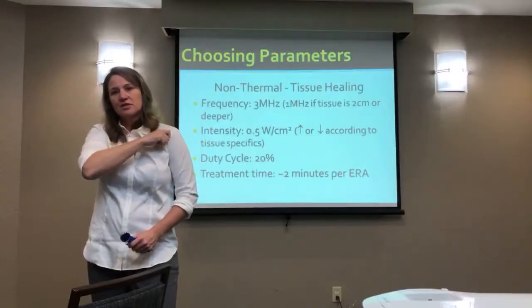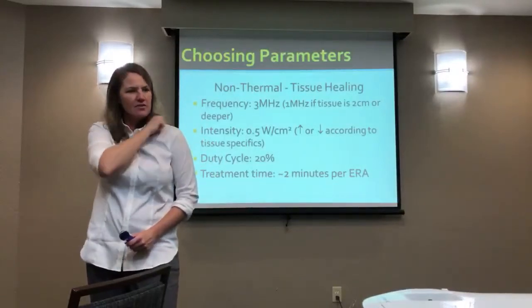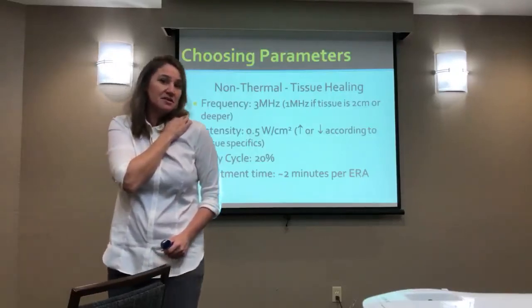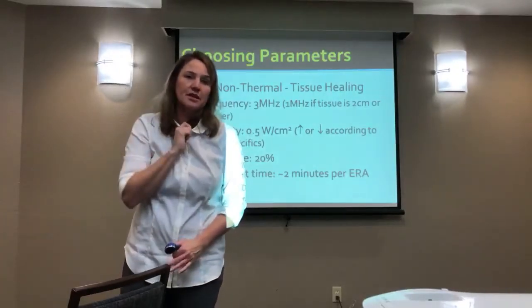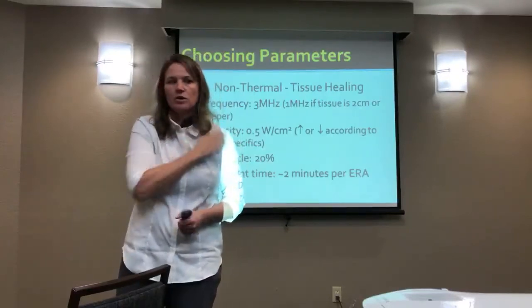Have your partner ultrasound it, make note of how it feels to palpation, and then have your partner ultrasound it and feel it again. And just see, same as with point stimulation yesterday. The same idea is try it for yourself and see how it works.